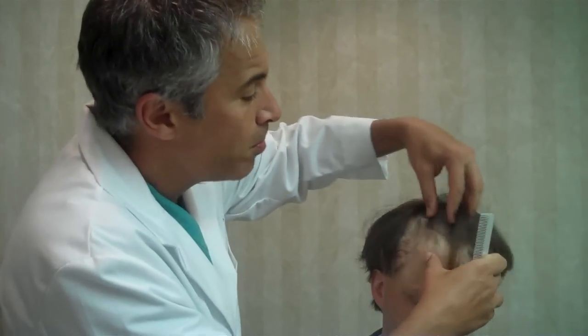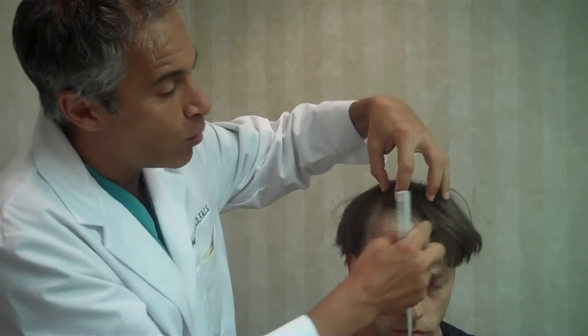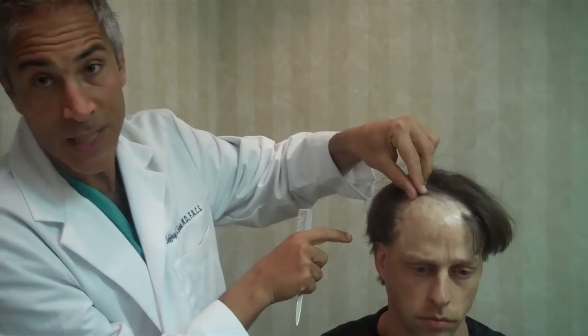We're going to do another cycle of tissue expansion. We're actually going to put 2 balloons in. I anticipate 2 balloons. One balloon's going to go up here. It's going to blow it up so this area is all stretched out. What that will do is it'll permit me to move this whole flap forward, cut out all the scarred tissue, and probably up to here.